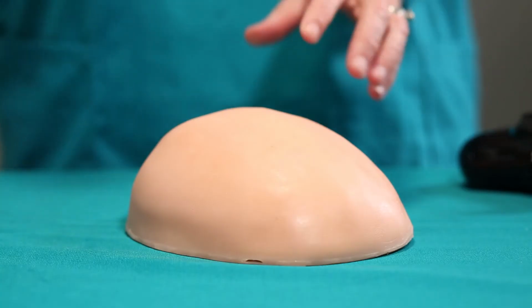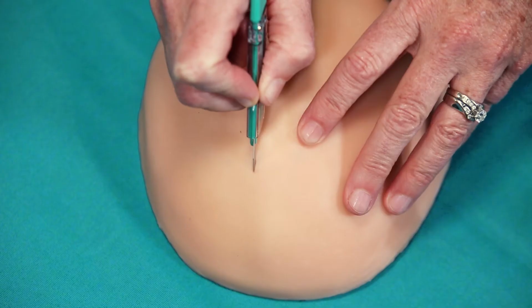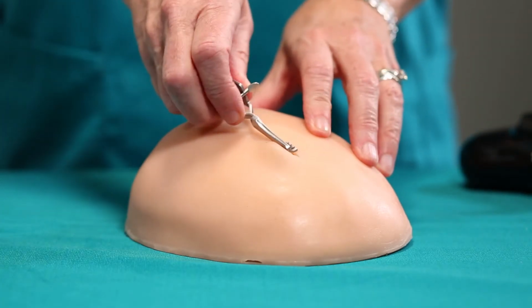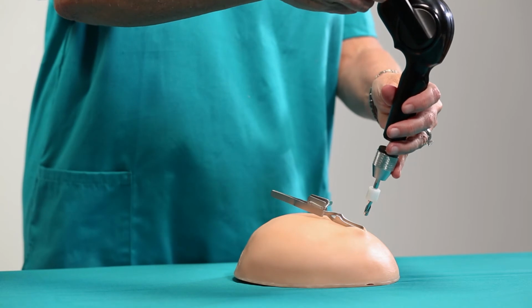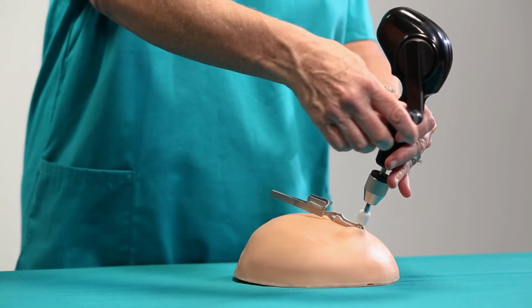Make an approximately 1-inch incision in the scalp down to the skull using the number 15 scalpel blade at Coker's point. Open the incision with the self-retaining retractor. Holding the drill at a 90-degree angle perpendicular to the skull, drill a burr hole using gentle pressure.